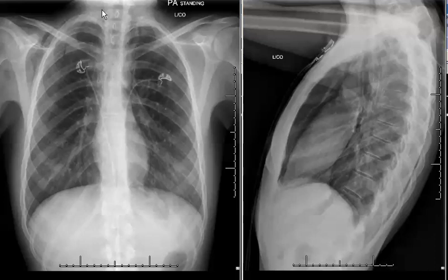A lot of times one of the clues is seeing pneumomediastinum tracking into the neck and the chest wall, as we see in this case. So that can be a great help in identifying pneumomediastinum.